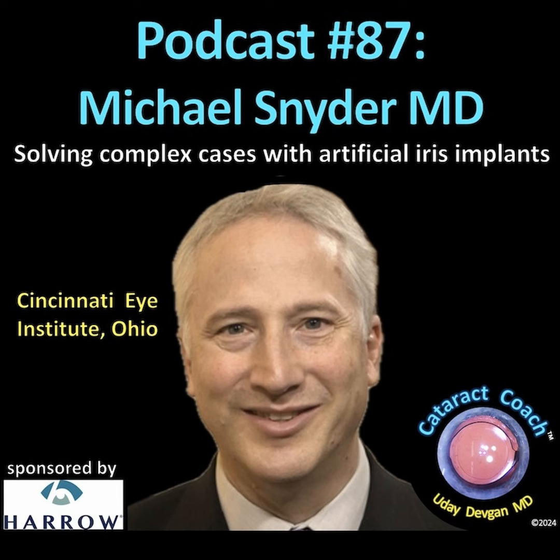Well, what's always surprised me when I see videos of these being done is just how large they are. This is much bigger than an IOL. And even the way you have a special technique of kind of shoehorning it into the bag. Yeah, and it's so nice because we can actually inject the ones that are going into the capsular bag through an IOL injector that goes through a traditional 2.2, 2.4 incision. But getting that 10 millimeter-ish diameter, we size them for the capsular bag. It's usually around 10, sometimes a little more, sometimes a little less. And getting a 10 millimeter device through a 5 millimeter capsulorhexis requires a little challenge.